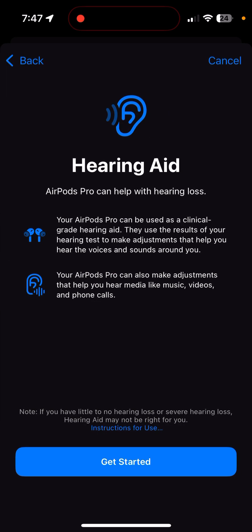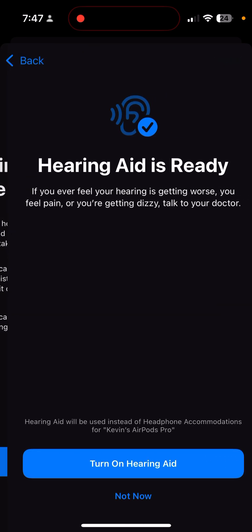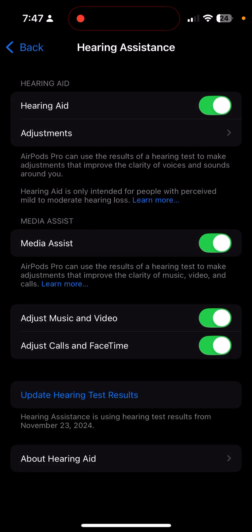When you click that, you're presented with an entirely new menu to set up the hearing aid — which seems silly. Go ahead and get started, click Next, turn on the hearing aid, and click Done. Now your hearing aid is enabled.